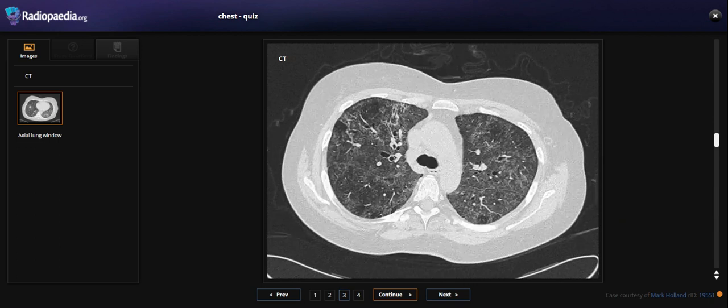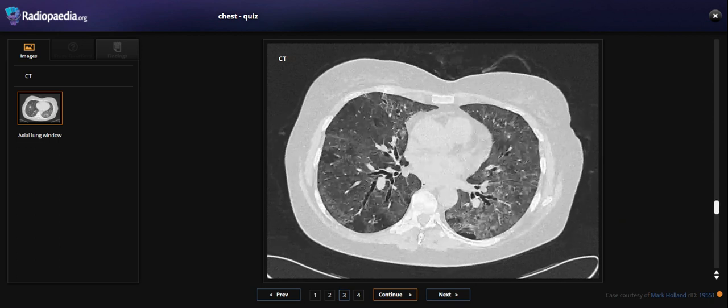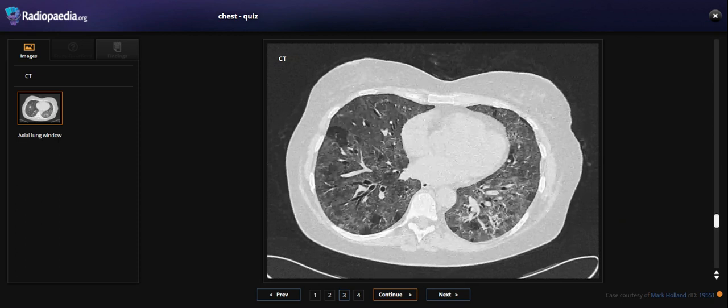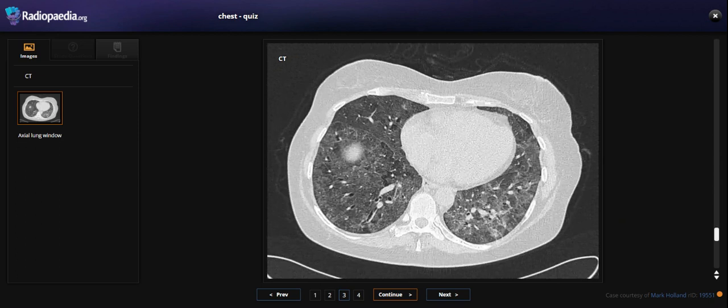We see some small nodules and some dilated bronchi, but not significant.